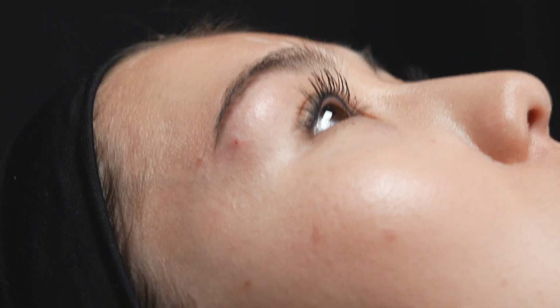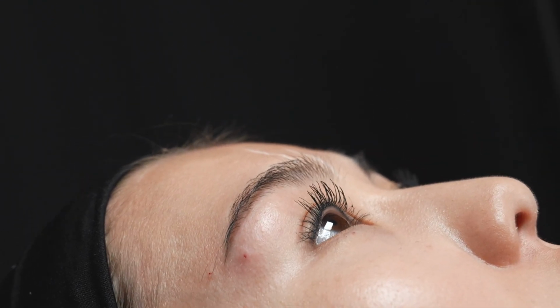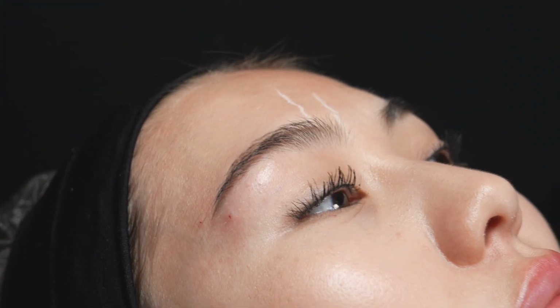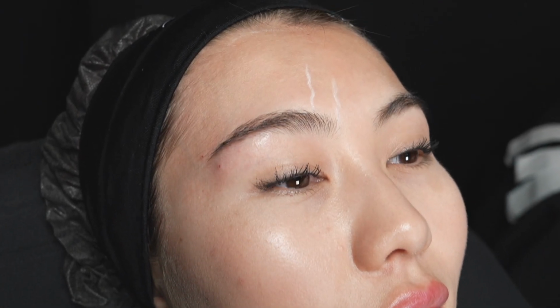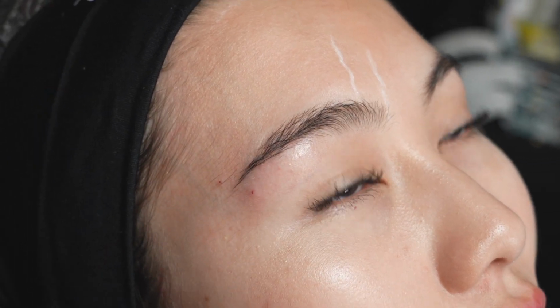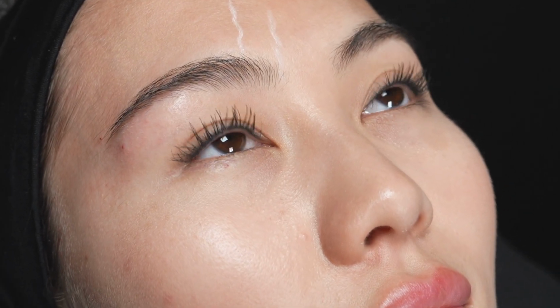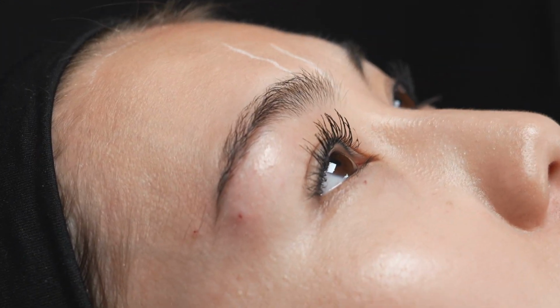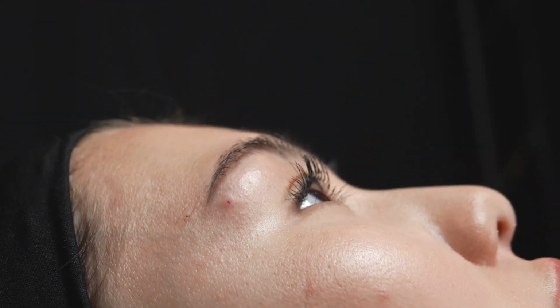Скажите, что по поводу миграции препарата вниз? Ага, хорошо. Если вы внутри руфа находитесь, то руф это очень закрытый жировой пакет, и продукт никуда не пойдет, ни вниз, ни вверх, как и в суфе. Суф это тоже закрытый жировой пакет. Если вы заходите вовнутрь корректного жирового пакета, в корректный слой, то продукты там и остаются.